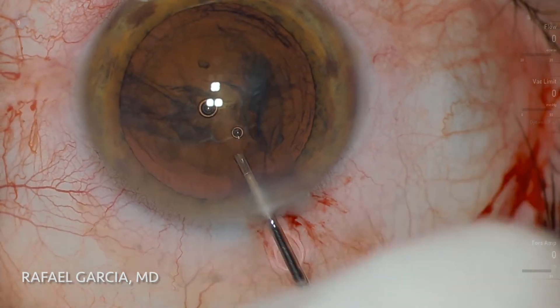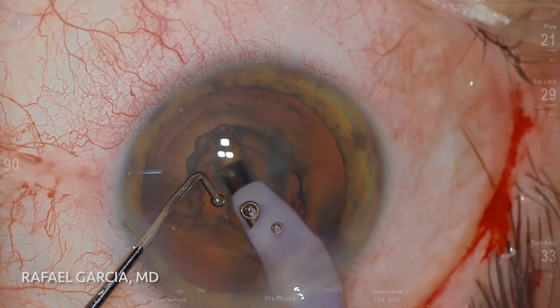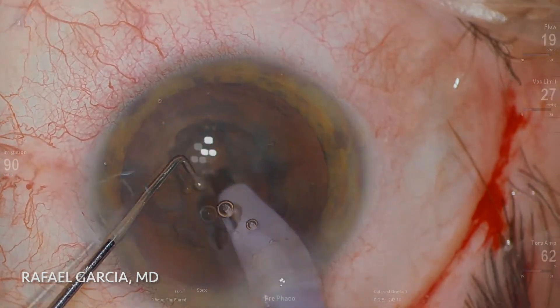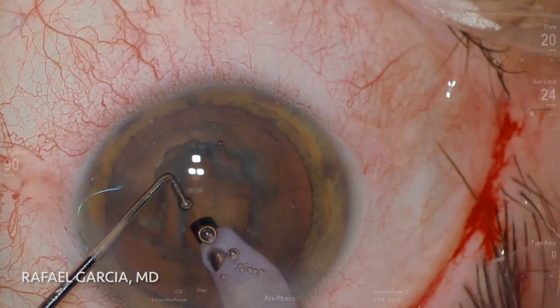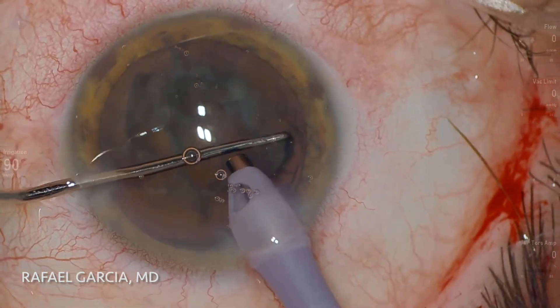Now comes the phaco probe. My favorite technique for nucleus division is the phaco chop. However, since it's quite a soft cataract, we consider that a stop-and-chop technique would be more appropriate for this case. So here we go, making a deep trench in the middle of the nucleus until we've gone about 80% in depth. The two instruments are then positioned deep inside the groove to split this cataract in two halves.